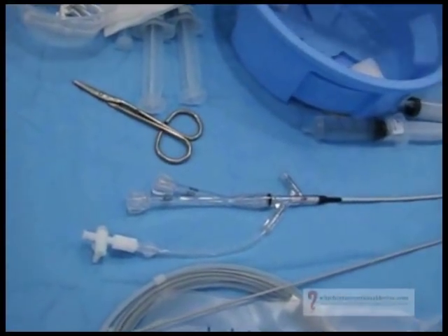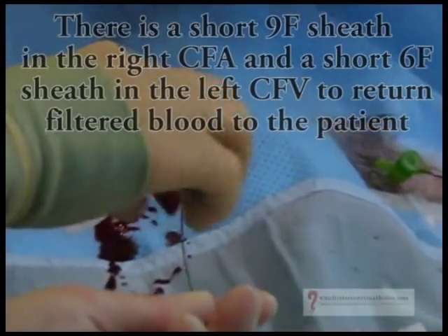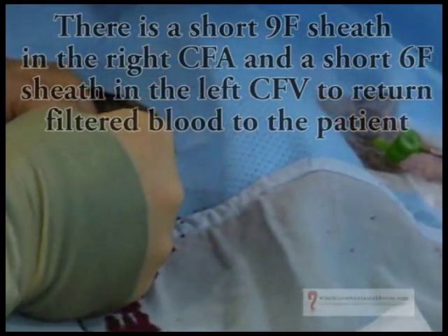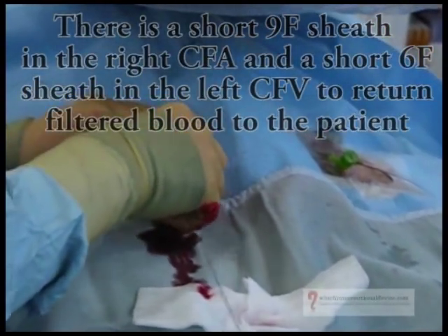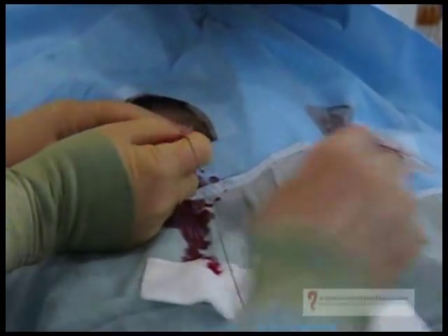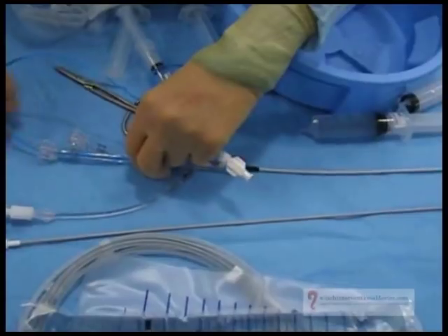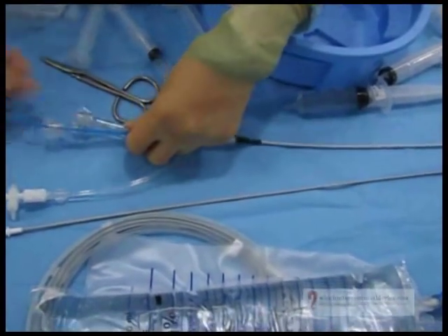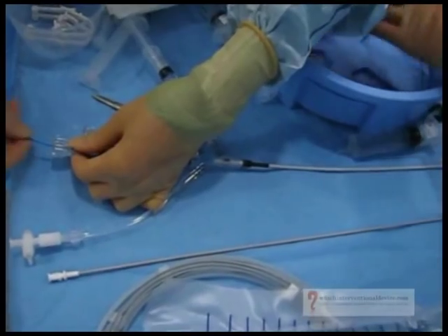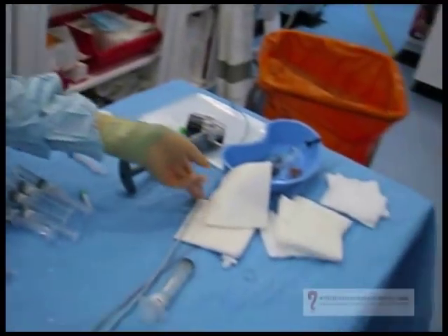What we will do is flush through. Let's have the catheter. This is a Cook Shuttle Headhunter that usually goes alongside the Cook Shuttle Select Sheath, but here we're going to use it as a combined system. What size catheter is that? This is a 6.5 French, 125 centimetre long headhunter shape that we're going to use as a coaxial system with the balloon sheath, to do the coaxial approach to access the common carotid artery.